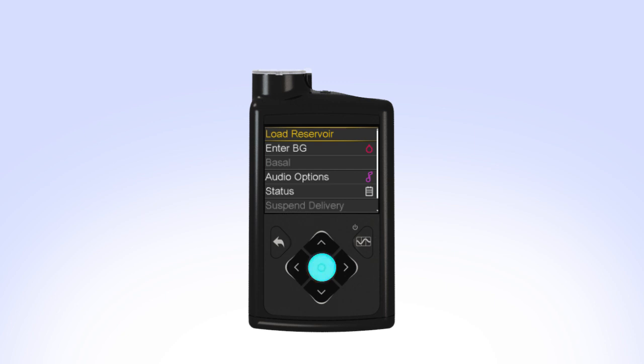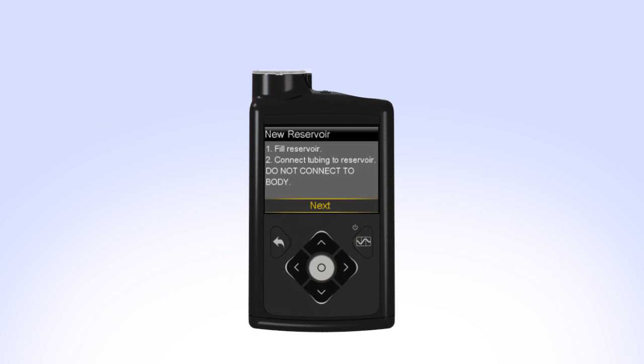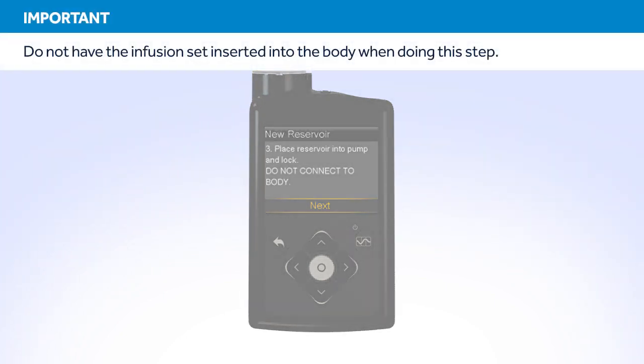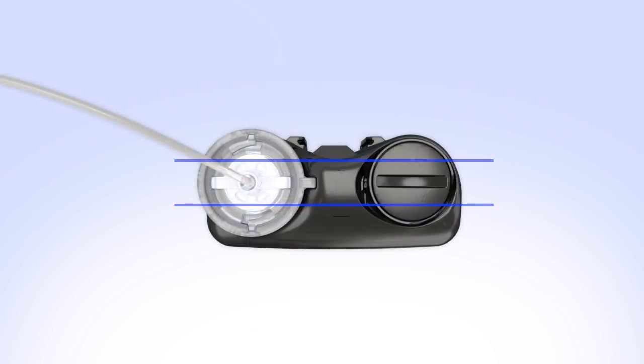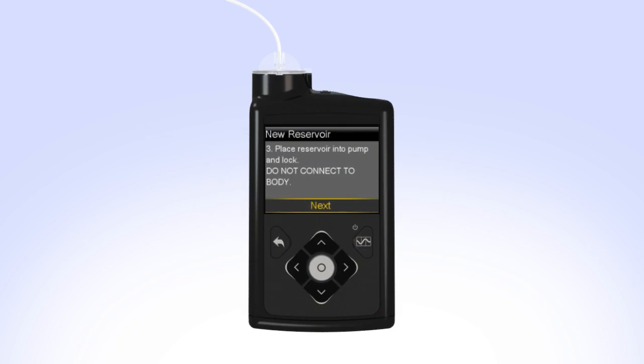Select Load Reservoir from the menu. The New Reservoir screen appears. Since you have already filled the reservoir and connected the tubing, select Next. The next step instructs you to place the reservoir into the pump and lock. Put the reservoir in the pump and turn the tubing connector clockwise until you feel the reservoir lock into place. The tubing connector should line up with the groove in the battery cap of your pump. Select Next to go to the Load Reservoir screen. With Load highlighted, press and keep holding Select until the screen shows Complete, Do Not Connect to Body, and a yellow checkmark, then select Next.